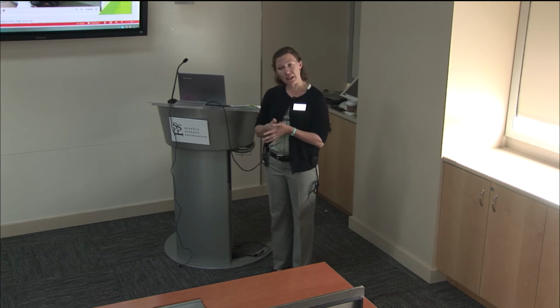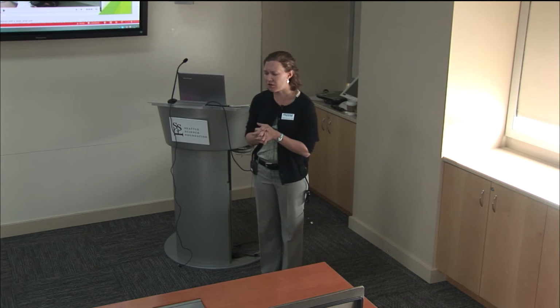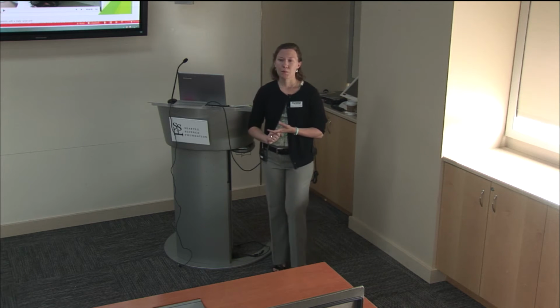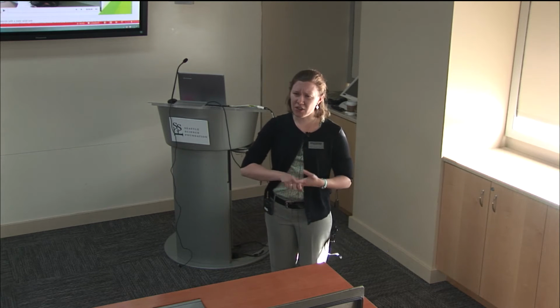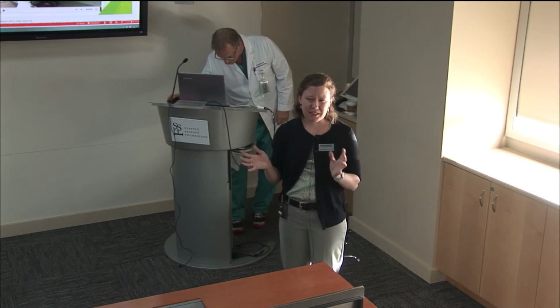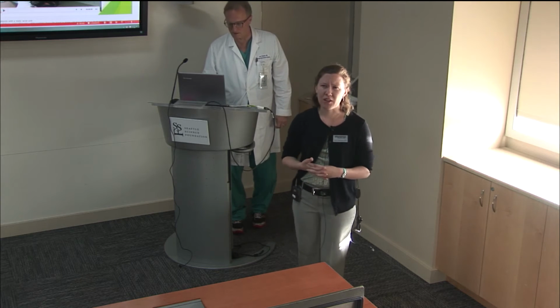At this time, Medicare is not paying. Medicaid is state dependent. I don't believe we've tried Washington State Medicaid yet, so I don't really have an answer for you on that one. But workman's comp, vocational rehab, and most private insurances are covering this. At what percentage are they paying for these prostheses? It kind of depends on the insurance policy. As a national average, somewhere between probably 65 to 80%, but it's really very much policy dependent.